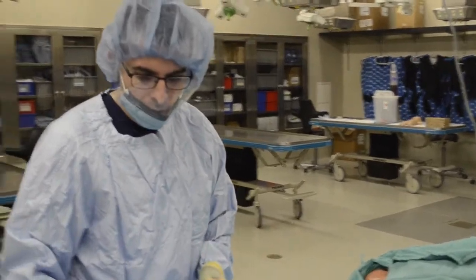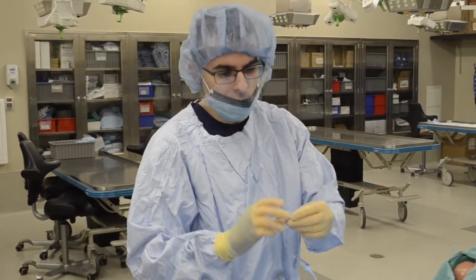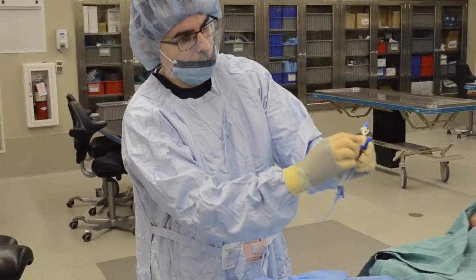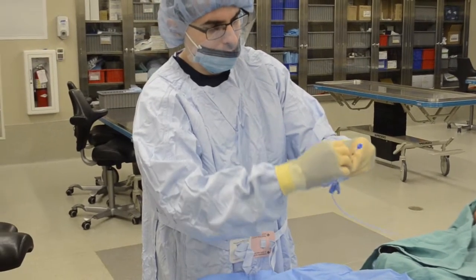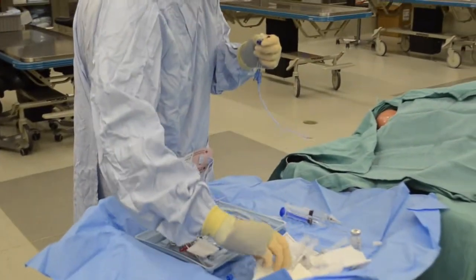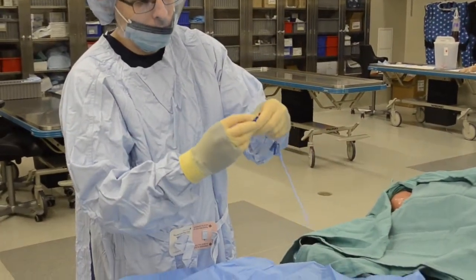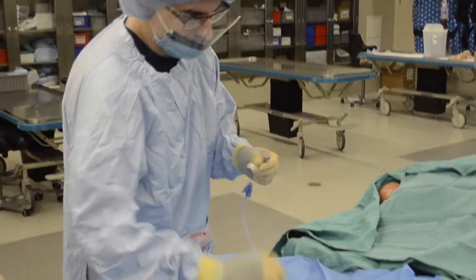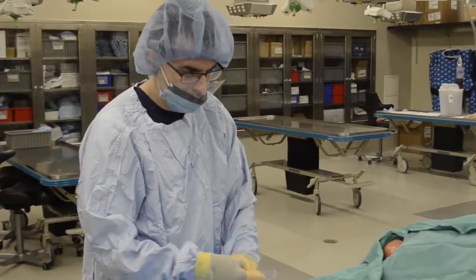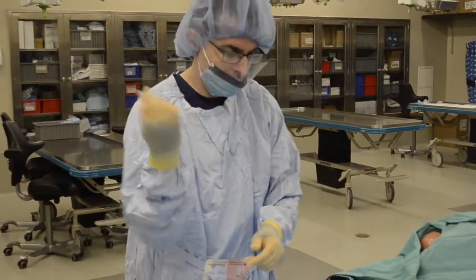In a crash line, we can hold off on this next step. But if you're doing a full sterile line where we're trying to do every step of the procedure, then the next thing is to just go ahead and attach our caps. So this one has a brown, a blue, and a white port. We can unscrew these. And then we're going to put our little caps that we have and attach them. One for the blue. One for the white. And this extra one will be for when we're finished with the procedure. So we'll just set this aside for right now.